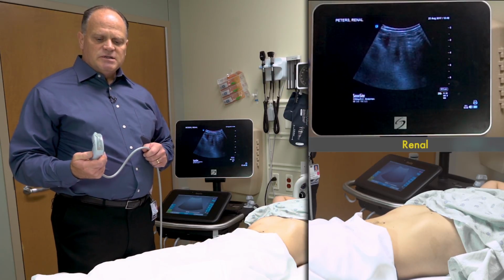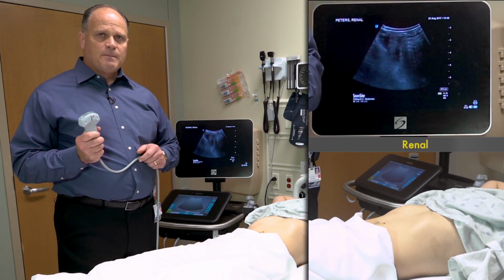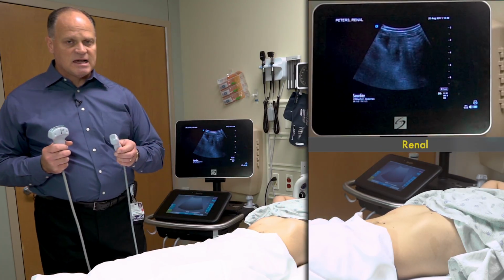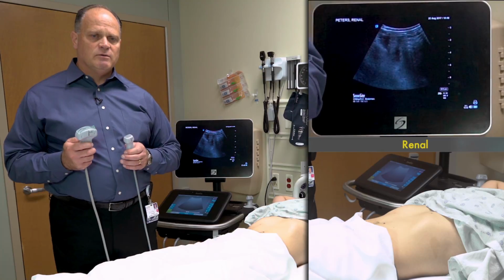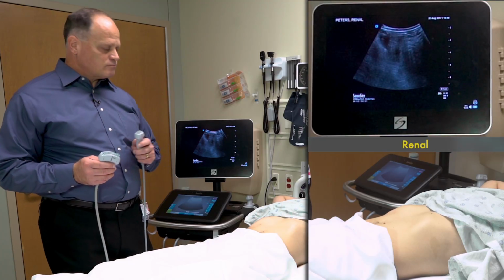When we do renal ultrasound, I typically still use the curvilinear probe. However, you can use the phased array probe if you'd like. And again, it's a probe that's designed to shoot through ribs. And when we're doing renal ultrasound in the emergency department, we're typically using the coronal view, which means that our probe is adjacent to the lateral side of the patient.